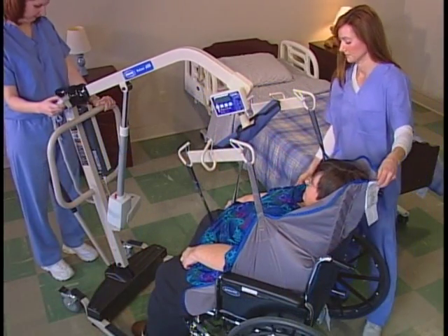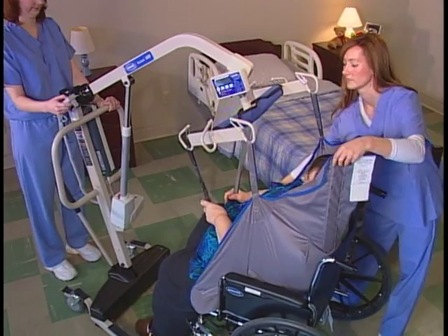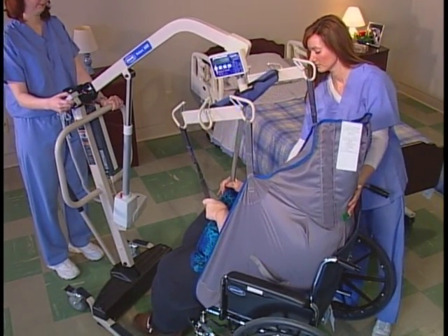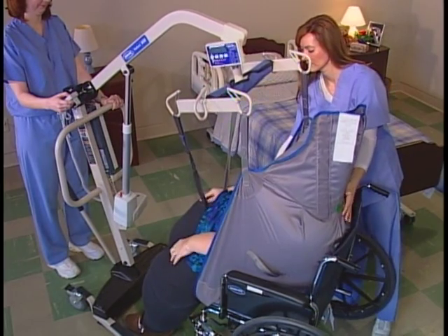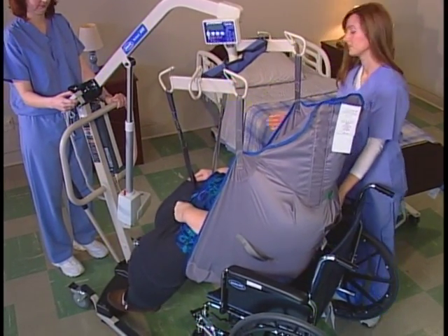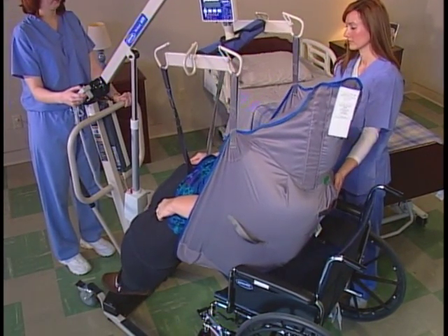Before you attempt any kind of lift, make sure that you understand the resident's limitations and their ability to assist with the transfer. It's a good idea to communicate with the resident throughout the process. Let them know about each step before you perform it so that the resident is comfortable and relaxed, and can help you in any way they can.